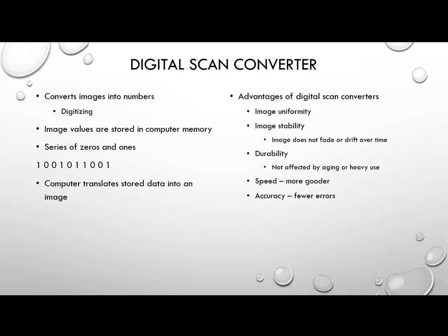The advantage of digital scan converters is you get very uniform images. The images are very stable because they're not relying on a signal coming in. They're relying on stored information in the computer. These digital scan converters don't get affected by heavy use or aging. The speed is much improved over the analog variety, and there's fewer errors, so there's absolutely no reason to use an analog scan converter.